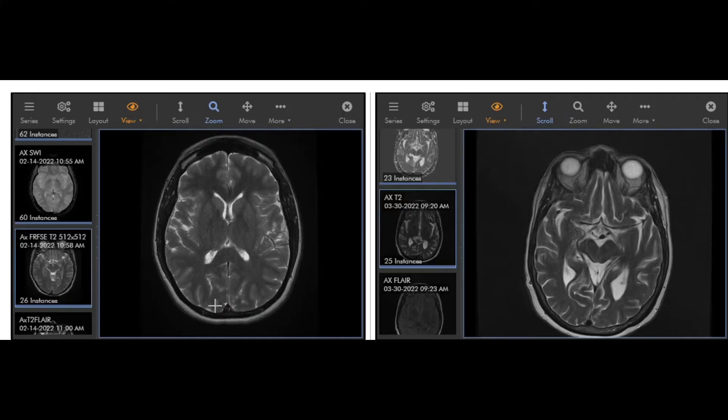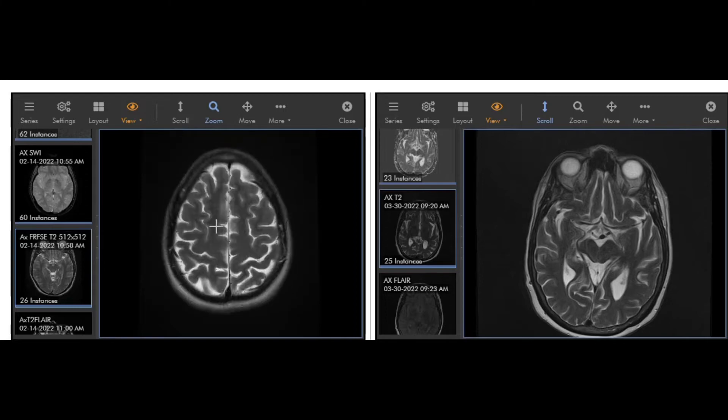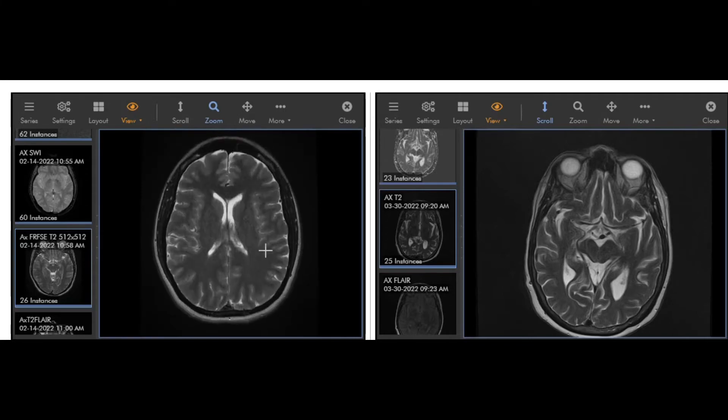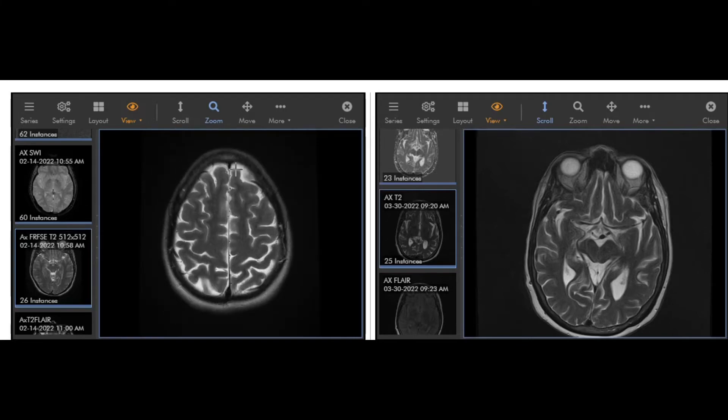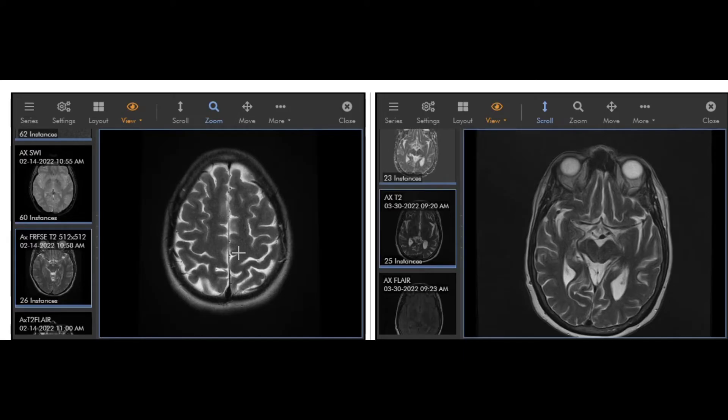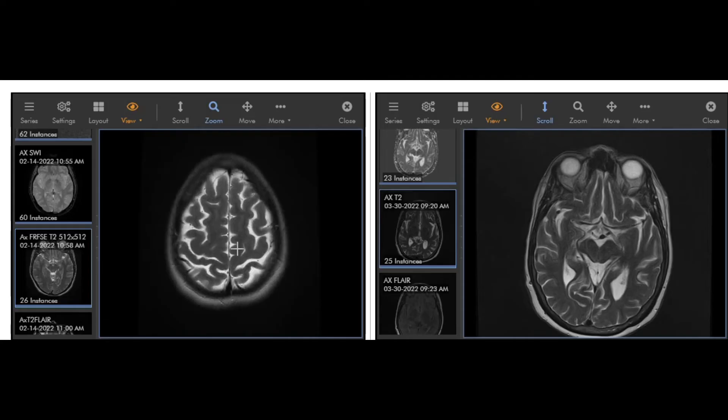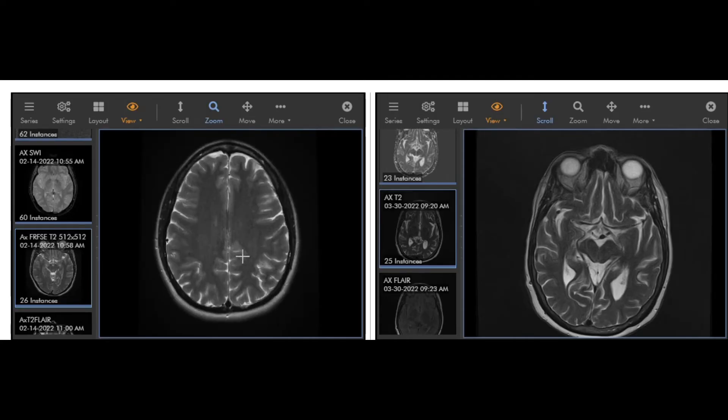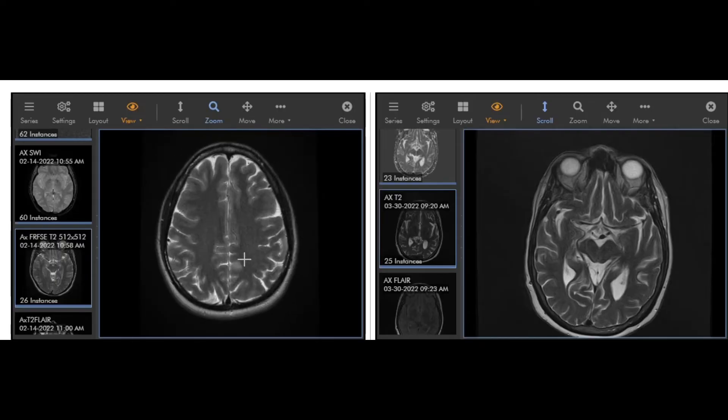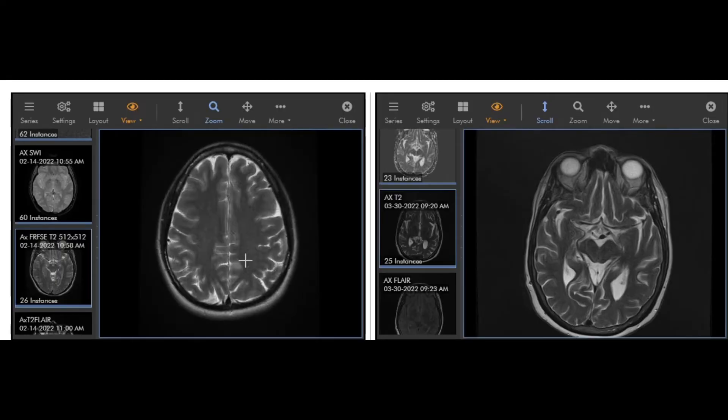The distinction between these is not that important for this particular video. But what I want to show is that you can see the cortex is robust here, it's basically filling the entire skull. So the skull is this black circle here, is basically bone. And you can see there's white in between the brain parenchyma here, and that white is the cerebrospinal fluid that the brain sits in.